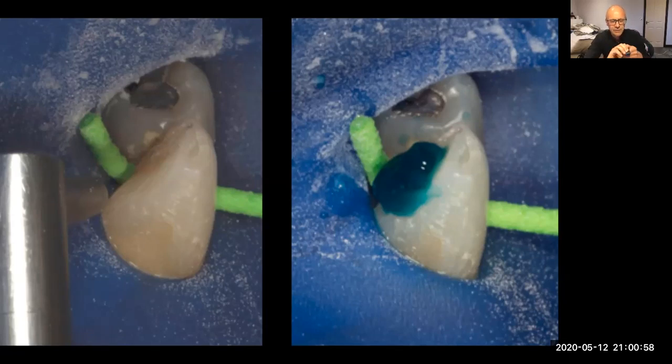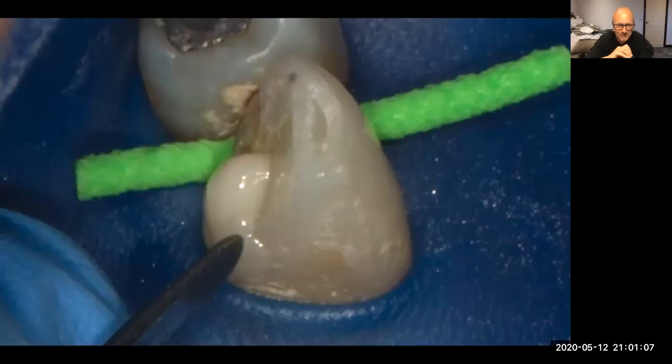And how I do it is I'm accentuating the cingulum. So sandblast. I've got my rubber dam on. Sandblast, etch, composite goes on, just like this. And then set it. The composite I use is HFO by Vanini. It's the Vanini's composite, HFO.